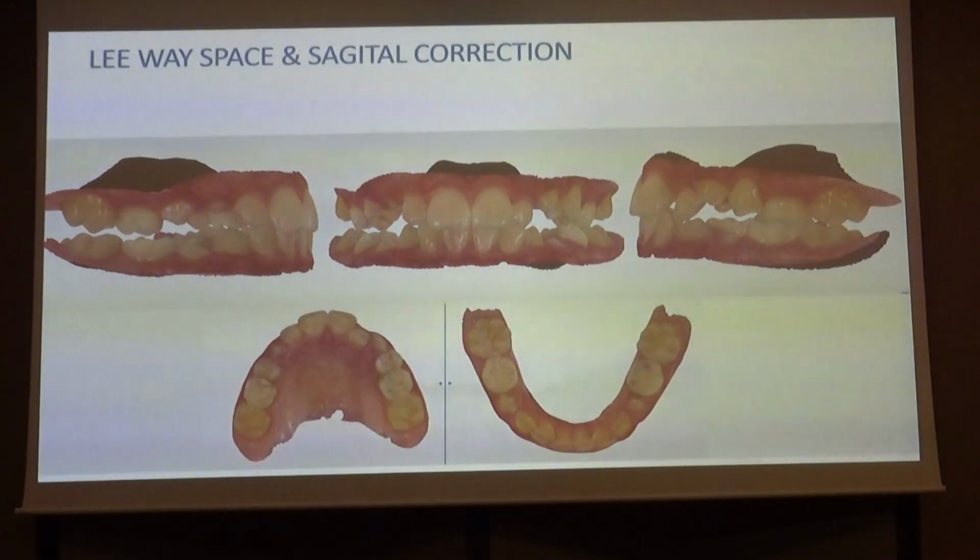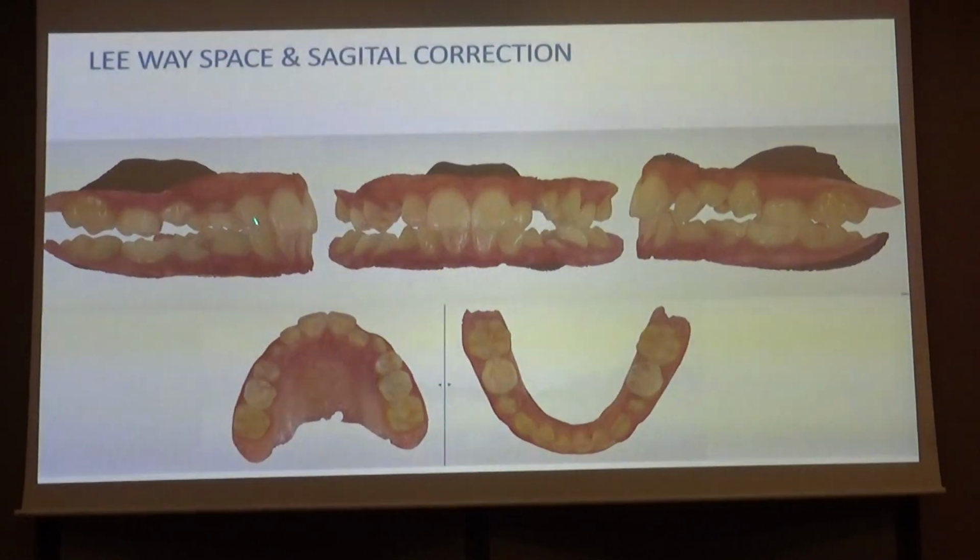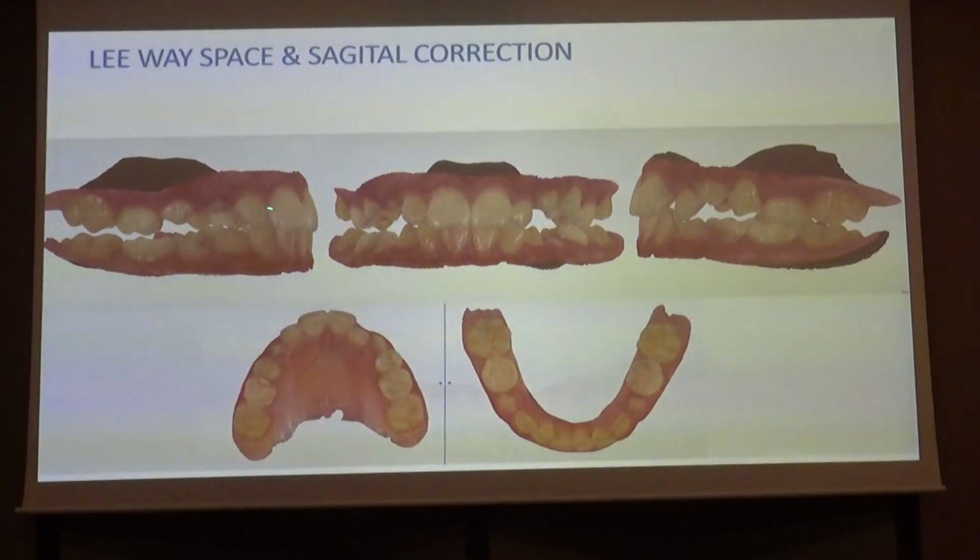So now it's much easier, right, to avoid this type of iatrogeny. I only need to keep this tooth distally with the same inclination. I need to avoid the root movement of this lateral.